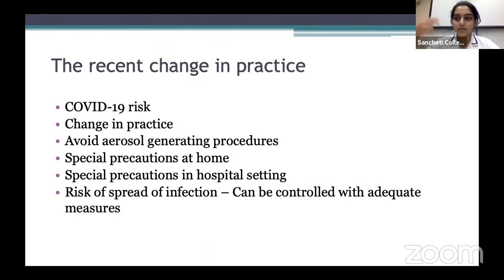It keeps flowing or changing. In such settings, if possible, make sure that the aerosol is being delivered in a negative pressure room, if available. Again, maintain social distancing between the patient who is getting the aerosolized medication and the healthcare personnel.